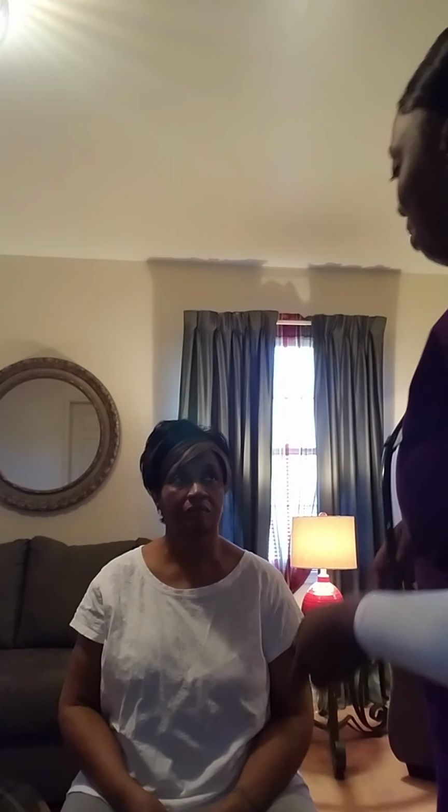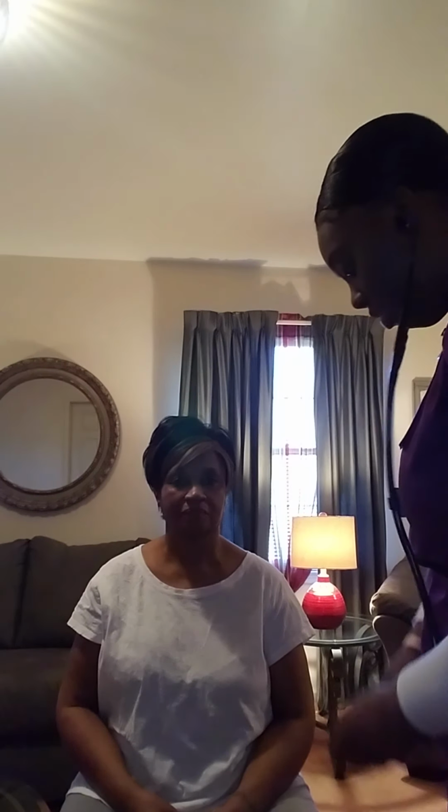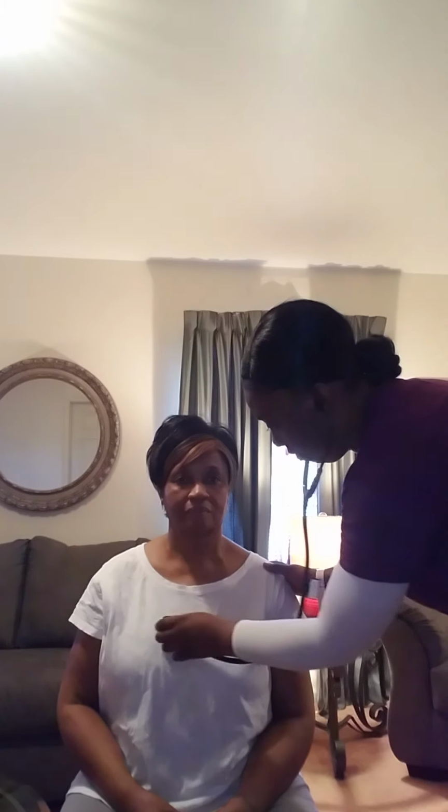As I move my stethoscope, Ms. Myrick, if you can just take a deep breath in and out. So we're going to demonstrate it. Perfect. Every time I do that, just do the same thing, okay? Perfect.